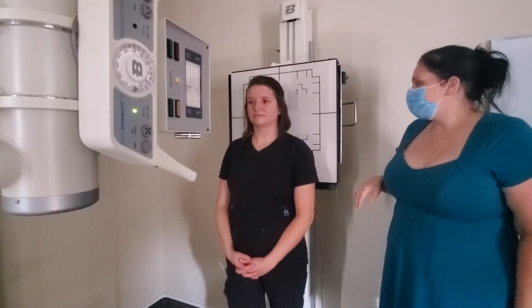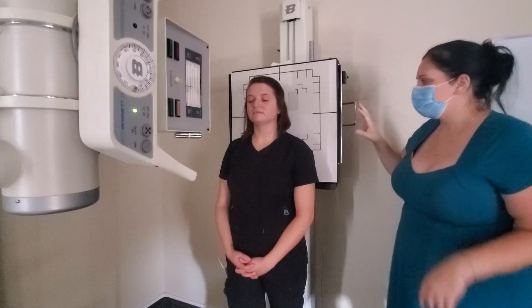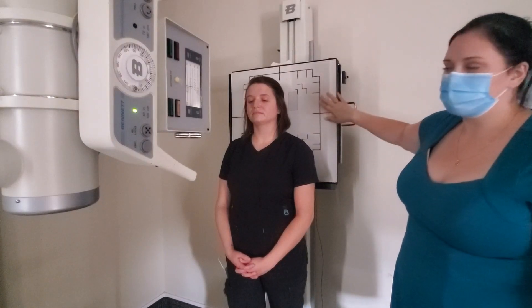The first projections we're going to do are for the dens. We're going to do the Fuchs method first and then the AP open mouth. Your dens projections should have a 10 by 12 crosswise cassette in the bucky.